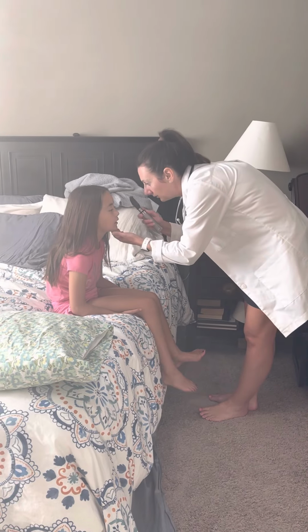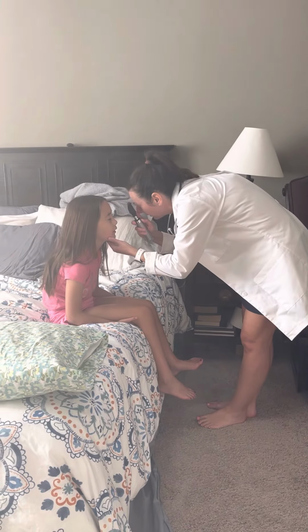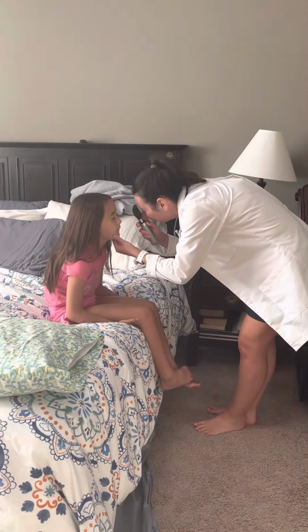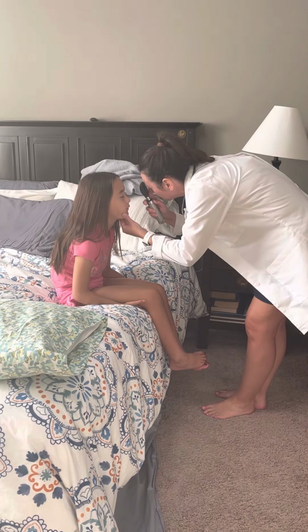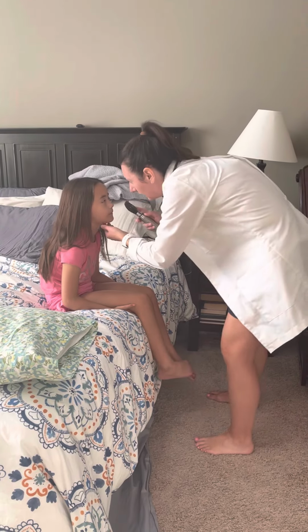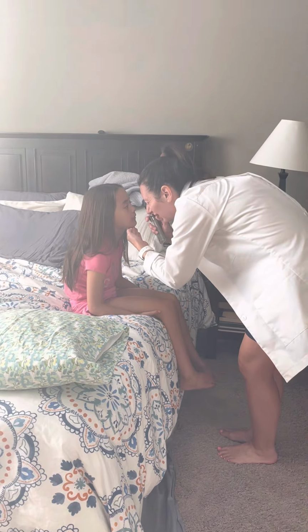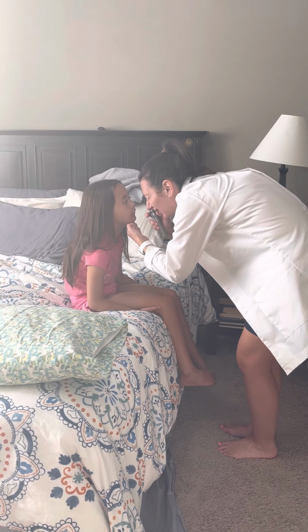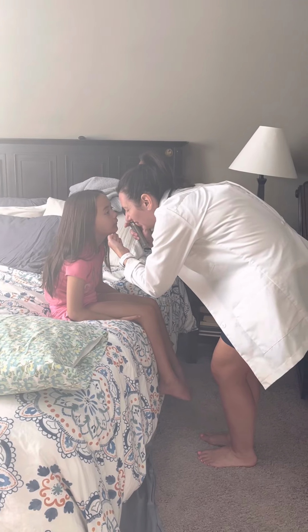And then I would have her look over my shoulder, and all I'm looking for is the red reflex. Can you look over my shoulder? Yep. And then I would examine her other eye. Yep. Good.